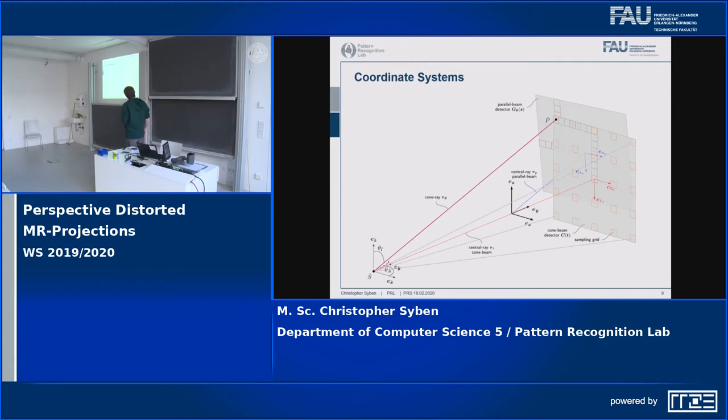You can see that this is the cone beam projection plane. And we can now think about what parallel projections we want to measure. If I talk later in the talk about a 5x5 rebinning, I mean that we take these orange grid sampling points, so 25 parallel projections, and then try to interpolate somehow towards the cone beam projection so we can directly fit it to the X-ray one.